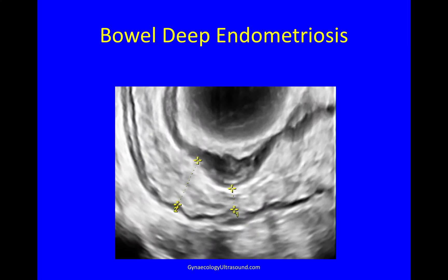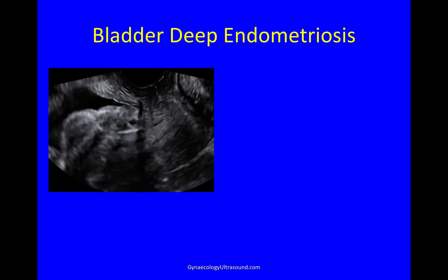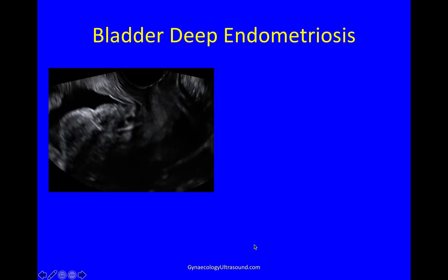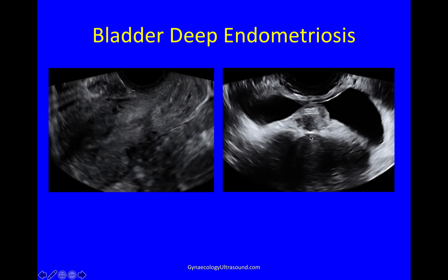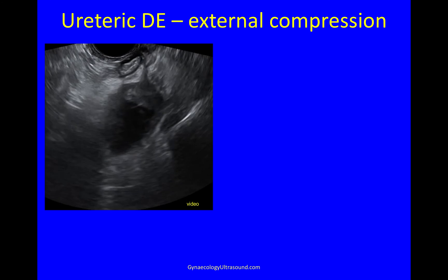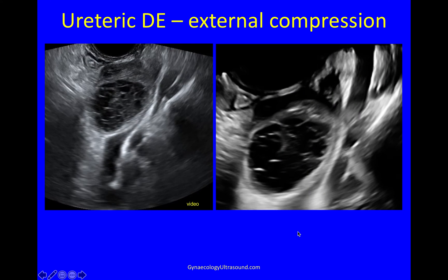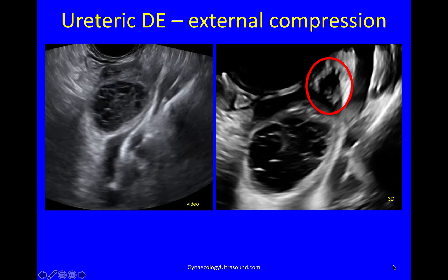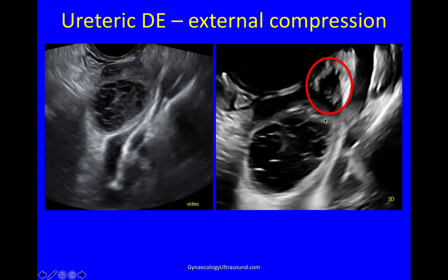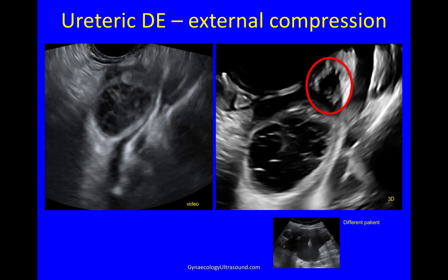3D is very useful for manipulating these images rather than moving the probe, which can be very painful in some patients. In a slightly different case you can see stenosis of the bowel compared to just distally, caused by a deep endometriosis lesion. Deep endometriosis can also occur in or just deep to the bladder, seen as an area of hypoechoic tissue on 2D and instantly recognizable on 3D. In a lady with endometriosis, the ureter and an ovary with a hemorrhagic cyst were seen to be adherent; on 3D a lesion of deep endometriosis with surrounding hyperechoic fibrosis had caused those adhesions. Always look at the kidneys when you see deep endometriosis, as patients can develop silent hydronephrosis.